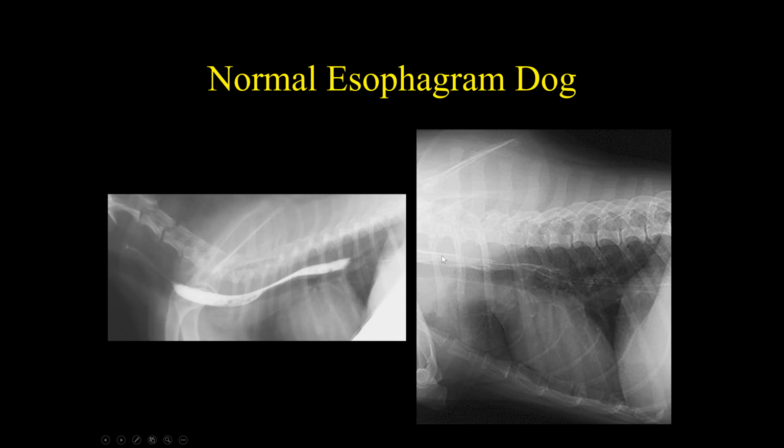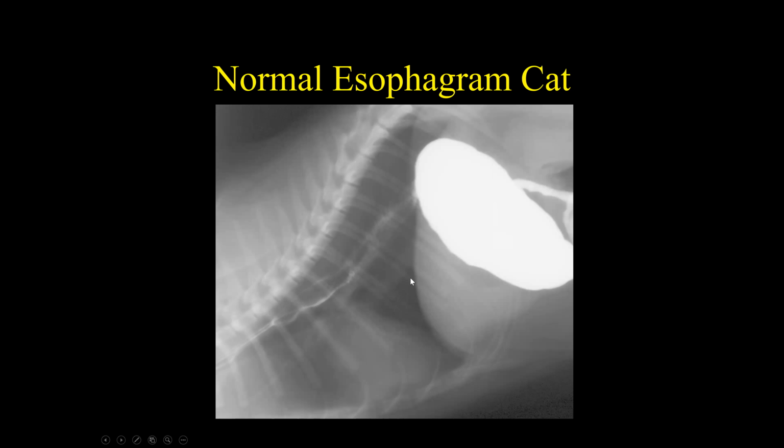Okay. If you take an X-ray afterwards, a lot of times you'll see this staining, if you will, where a little bit of barium is still hanging out in the esophagus, and you can see these linear areas of being striped, which is typical after the barium has moved through. Okay. But you shouldn't have big collections or dilated esophagus or pooling of the barium that just sits in the esophagus.